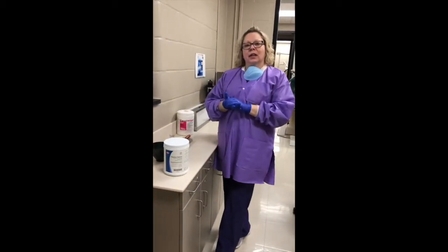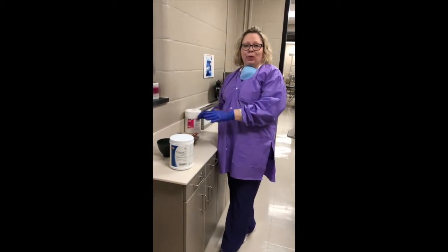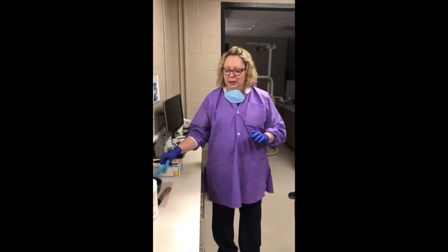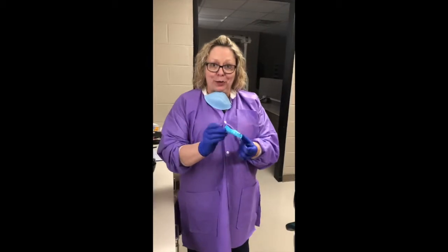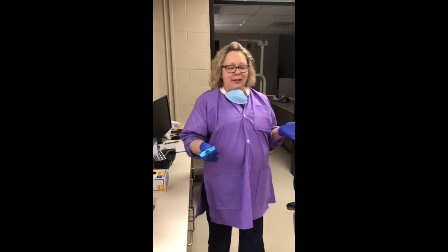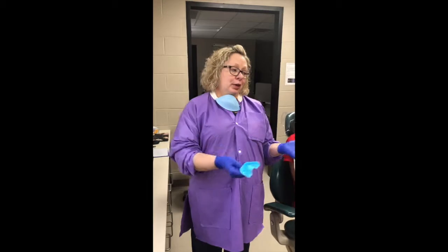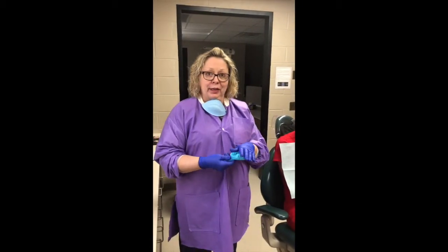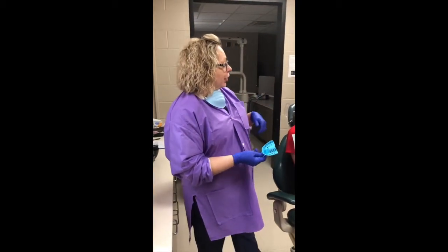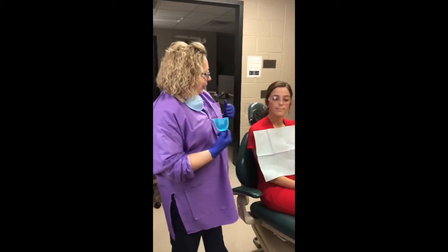Now that we've gone through all that, we're going to try on our tray for our patient and make sure we have the right size, and then we will start to mix our material. I have a volunteer patient here who is going to allow me to fill this little tray with some goopy stuff and take an impression of her teeth. We've already discussed in lecture the properties of alginate and how it sets up. The students have mixed it, put it in a tray, and taken an impression on a dentiform previously. But this will be their introduction to taking it on a real patient that has lips and cheeks and a tongue and all that stuff.